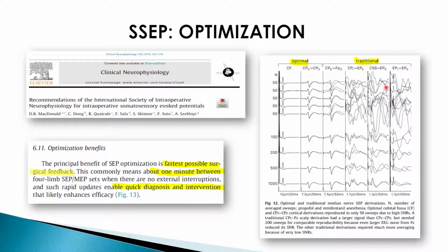I personally like seeing the cervical response and the subcortical response. I feel like it gives me more troubleshooting tools. However, for the sake of time and turning around your data, this might be optimal.